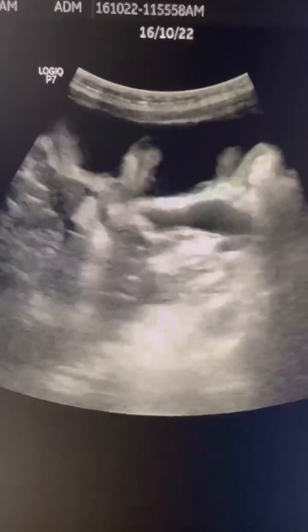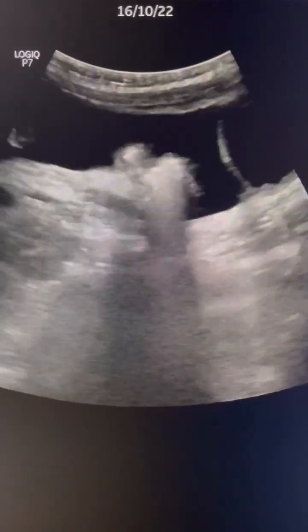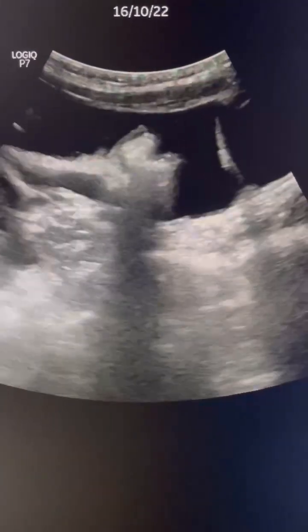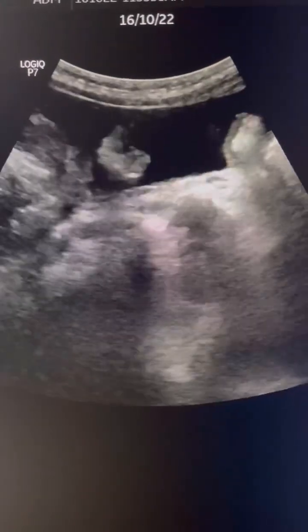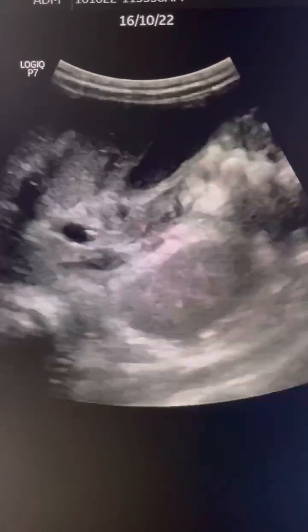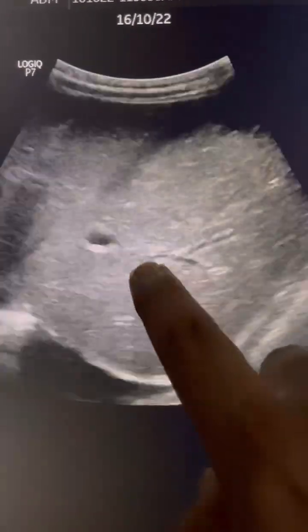You can clearly see that this patient is having free fluid in the peritoneal cavity. The free fluid is clearly visible, and there are infiltrative changes in the liver.